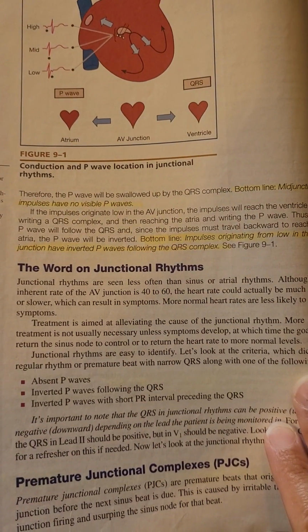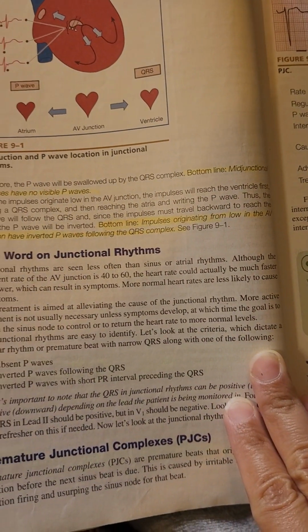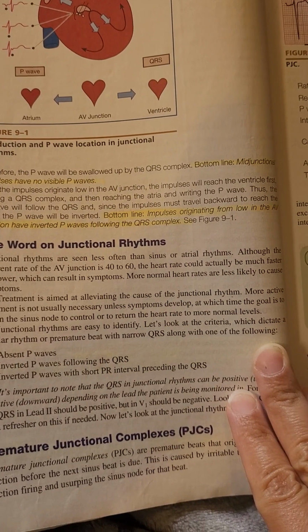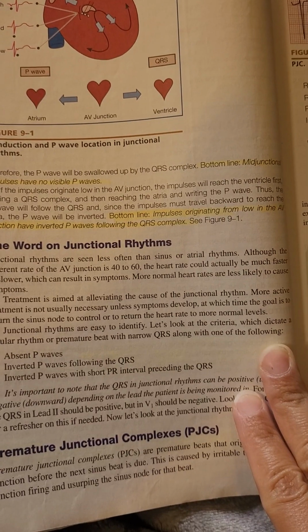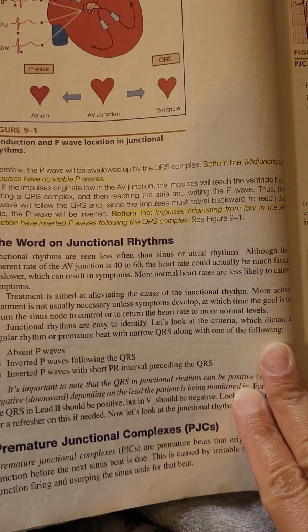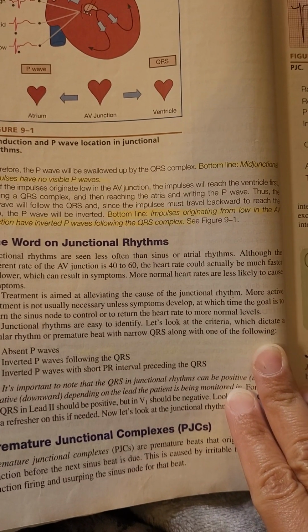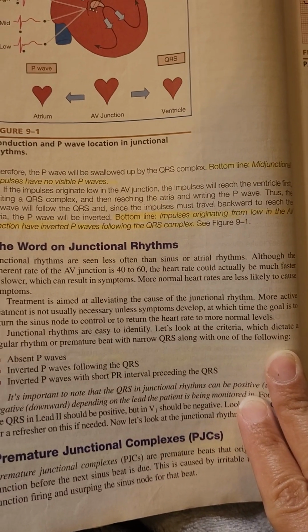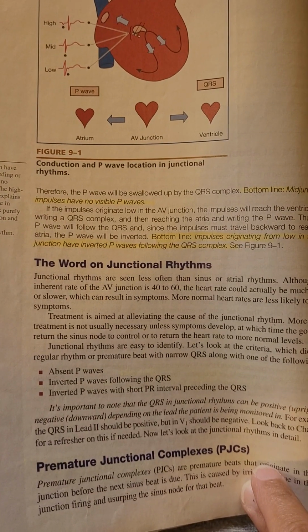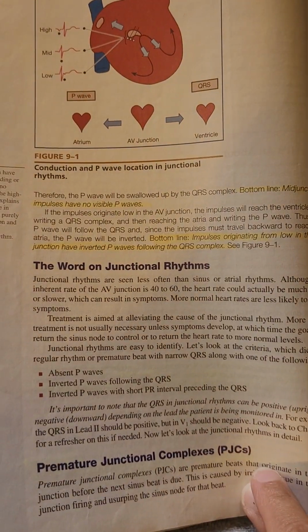If the impulses originate low in the AV junction, the impulses will reach the ventricle first, writing a QRS complex, then reaching the atria and writing the P wave. Thus, the P wave will follow the QRS, and since the impulses must travel backward to reach the atria, the P wave will be inverted. Bottom line, impulses originating from low in the AV junction have inverted P waves following the QRS complex.